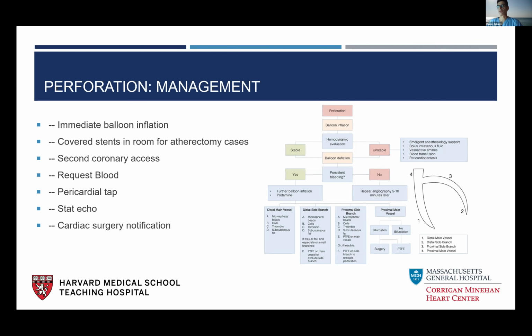So even if you deliver with a lower pressure, always take a high-pressure balloon, then do IVUS, to make sure that you, first of all, seal the perforation, but also that the stent is well expanded. There are some people who put a drug-eluting stent inside, which is, again, off-label, but they're concerned about the risk of restenosis since Papyrus and Graftmaster are both essentially bare metal stents with a PTFE membrane. So having a drug-eluting stent might reduce the risk of restenosis, especially if you put multiple of them.